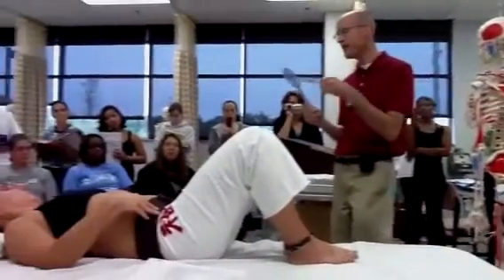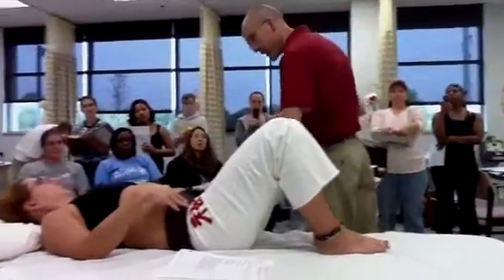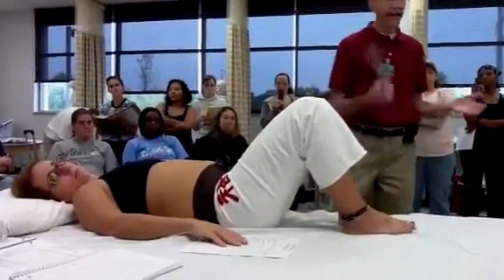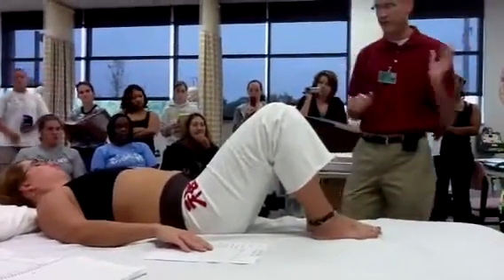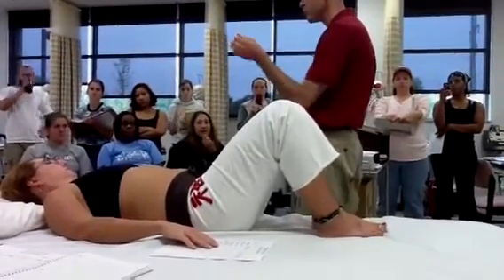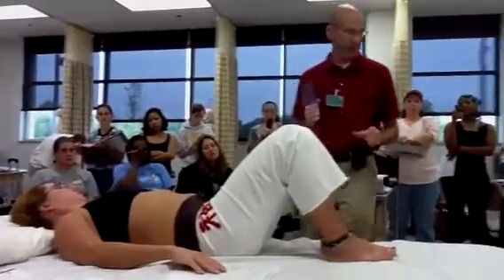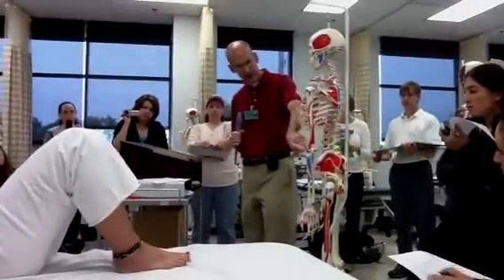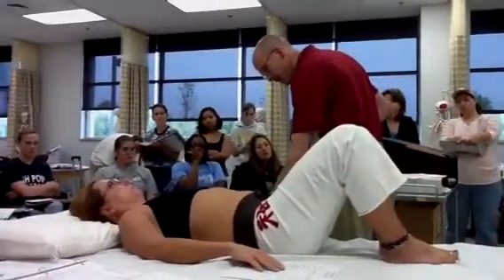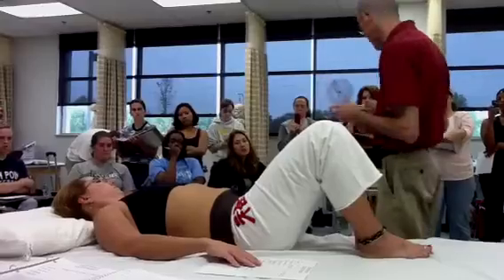What are you going to use to line up the proximal non-moving arm of your goniometer? So mid-axillary line of her body, a line that goes right through her axilla down her trunk. All right, and so that's not a bony landmark, so you don't have to palpate that. And what am I going to line up the distal or movable arm of the goniometer with? Okay, so lateral epicondyle, I'll ask you to come palpate that on the skeleton, and then show me on the patient, lateral epicondyle. We're going to see you actually make those palpations.